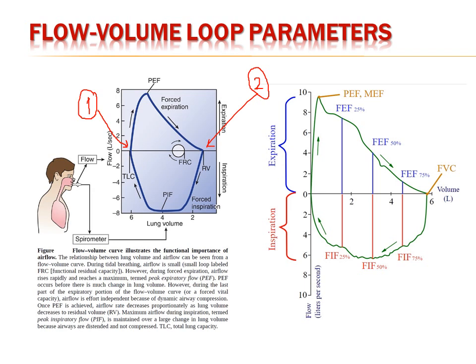What is important as a parameter is to measure the peak expiratory flow, or the maximal expiratory flow, which is the same. Some physiological parameters are considered more important than the peak expiratory flow.